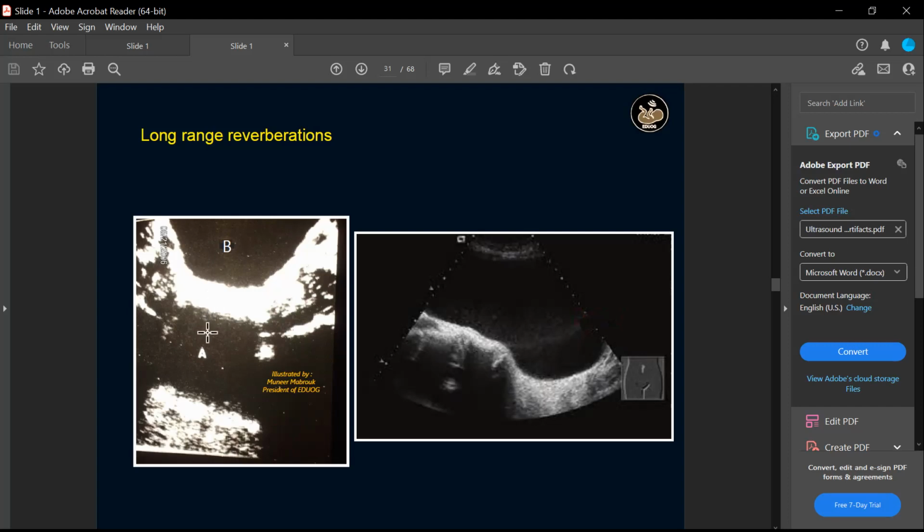So what was this darkness? What I call shadowing. This is shadow from the coccyx bone that appears black. Now, imagine the sound that comes to the bladder reached the coccyx bone so fast because it is not attenuated by the uterus.